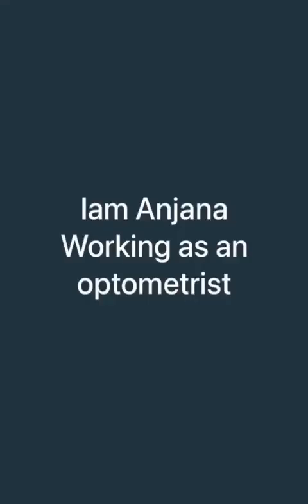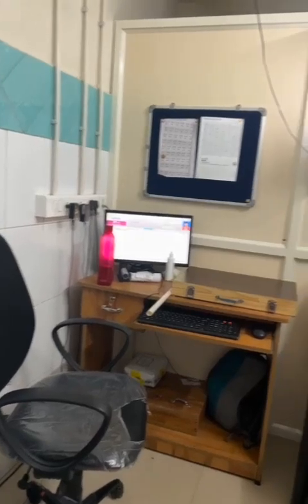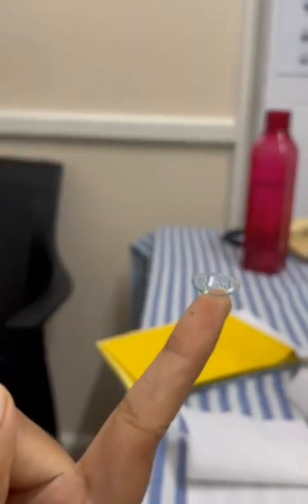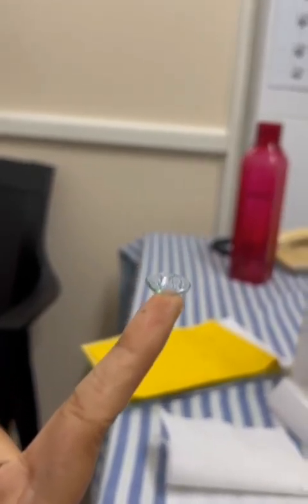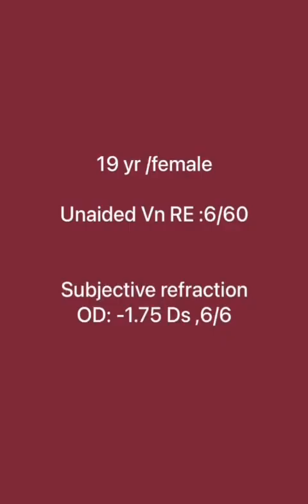Hi, I am Anjana, working as an optometrist and pursuing a fellowship in contact lens. Here I am discussing the insertion and removal technique of soft contact lens. I have a patient, a 19-year-old female, whose subjective refraction is about minus 1.75 diopter sphere. So let's discuss about contact lens.